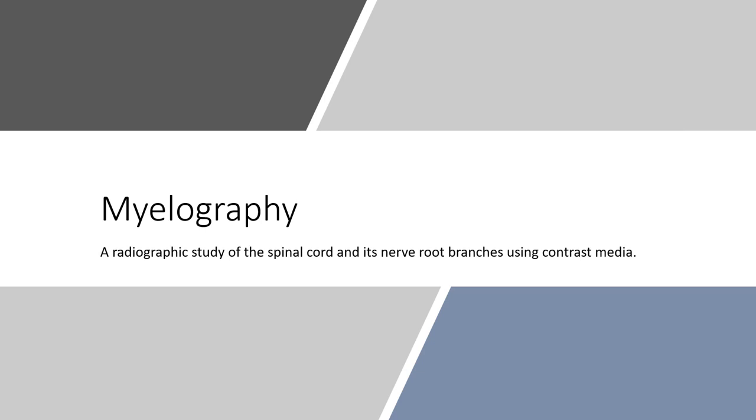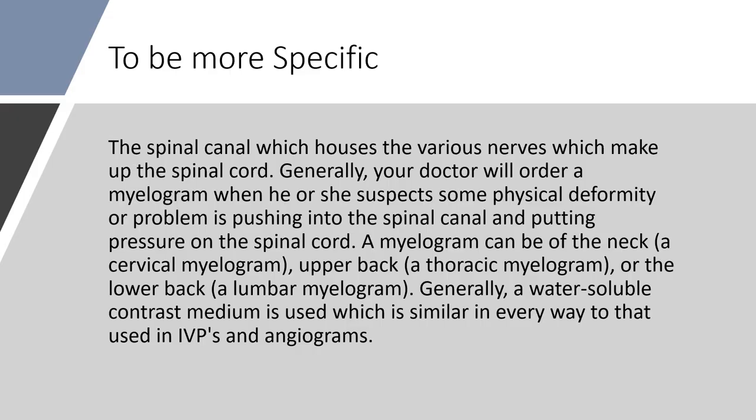Myelography, a radiographic study of the spinal cord and its nerve root branches using contrast media. To be more specific, the spinal canal, which houses the various nerves which make up the spinal cord. Generally, your doctor will order a myelogram when he or she suspects some physical deformity or problem is pushing into the spinal canal and putting pressure on the spinal cord.